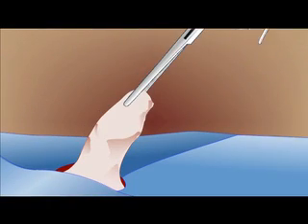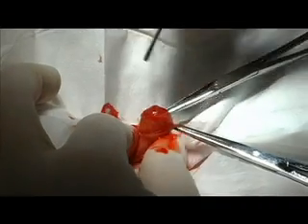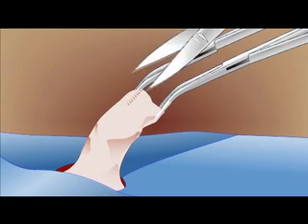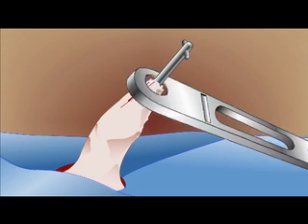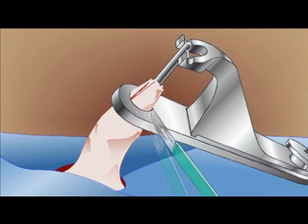Circumcision of the male newborn is a surgical procedure used to remove the foreskin of the penis, including the inner foreskin, exposing the glans. Neonatal circumcision is one of the most commonly performed surgical procedures. This video will demonstrate the technique of circumcision with the use of a circumcision clamp device.